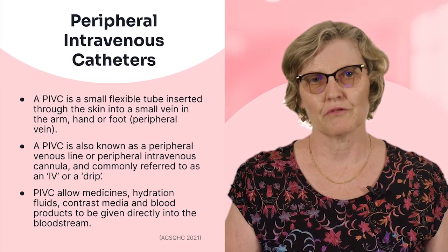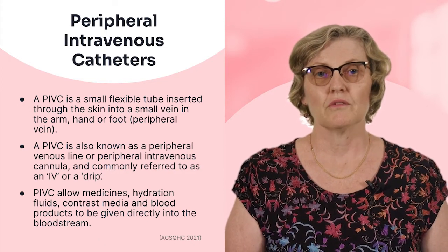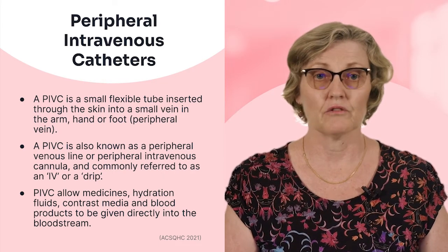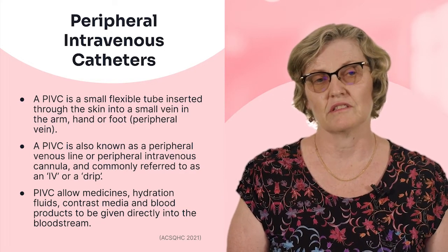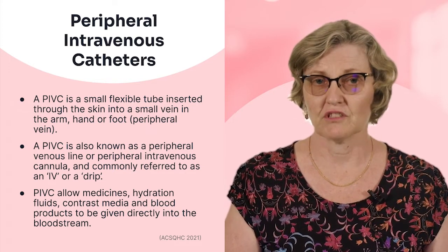Today I'll be speaking about peripheral intravenous catheters, best practice guidelines, and update. Our mission at AVATAR is to make vascular access complications history. So, peripheral intravenous catheters, as you know, are a small flexible tube inserted through the skin into a small vein in the arm, hand, or foot. They're also called a peripheral venous catheter, cannula, an IV or a drip, and PIVCs are inserted to allow medications, fluids, blood products, or contrast media to be given directly into the patient's bloodstream.